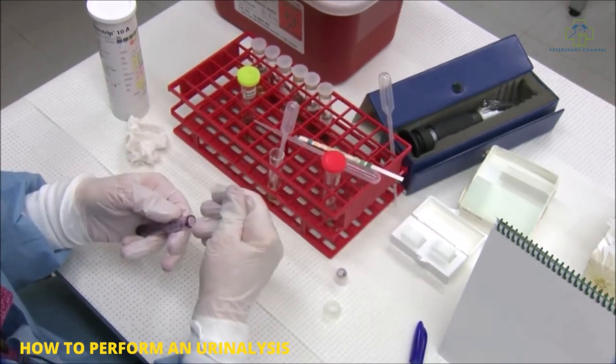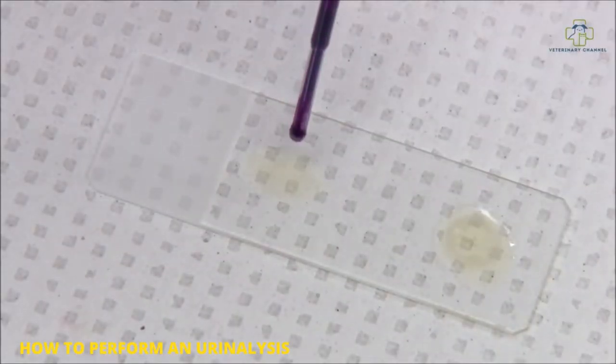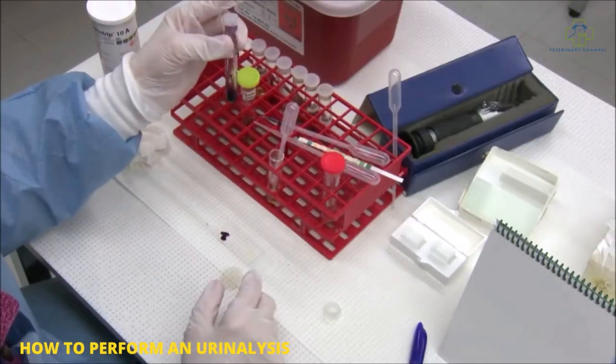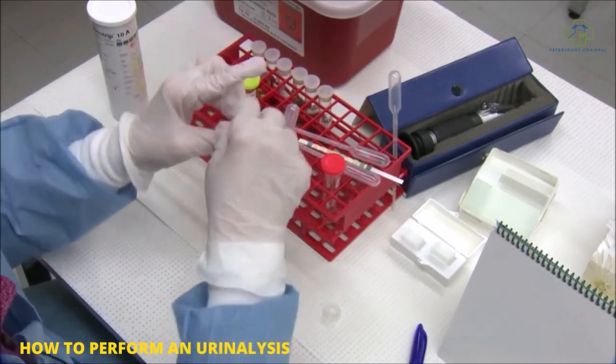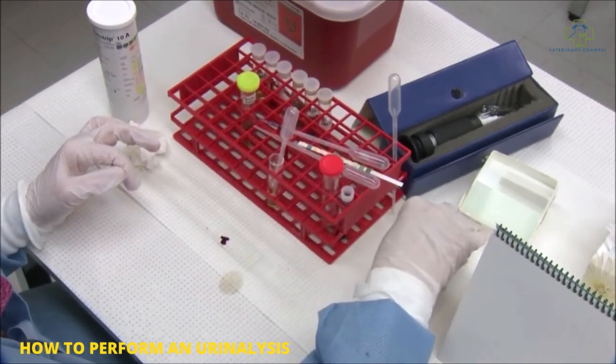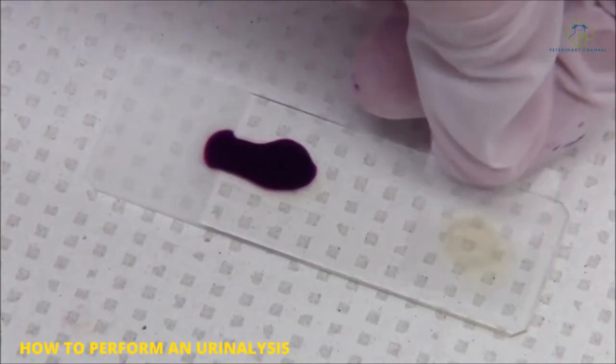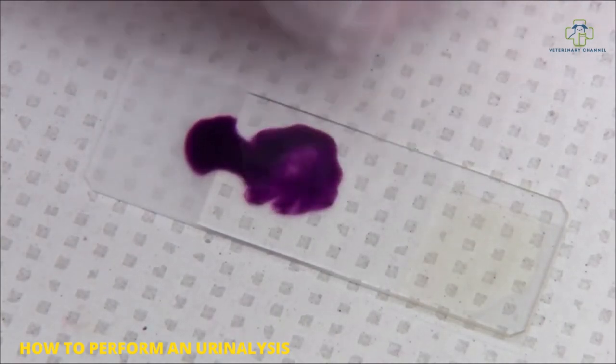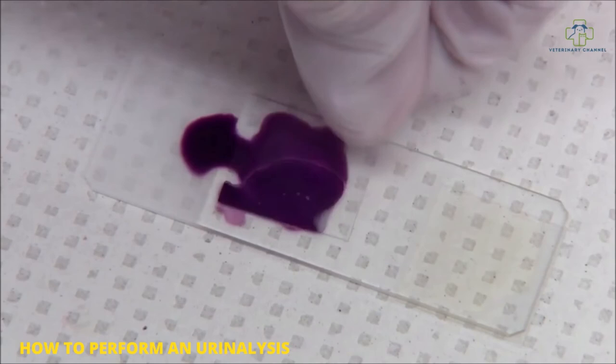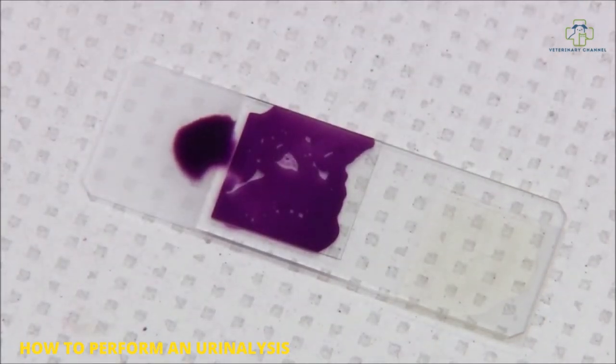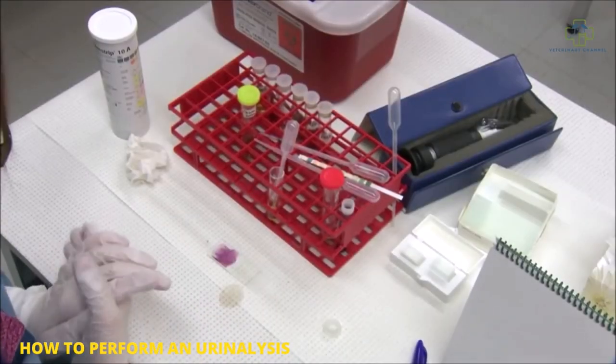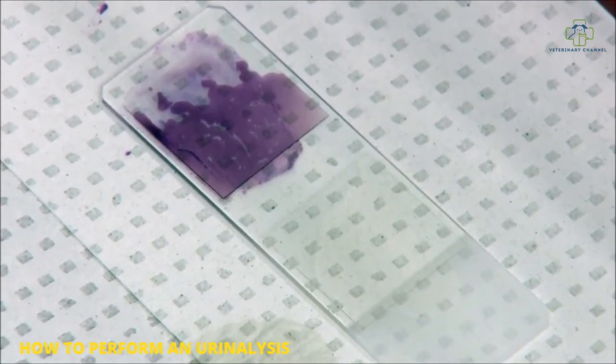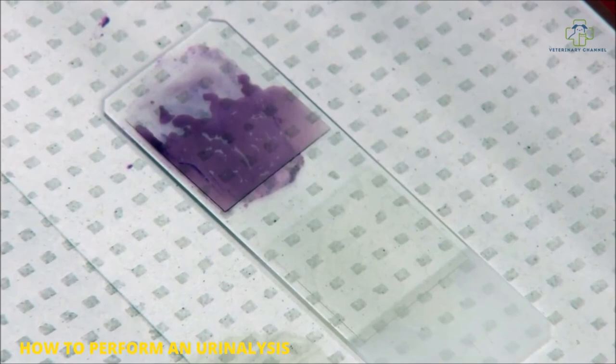Into one of those drops you add a drop of study stain. We aliquot our study stain into little containers so there's less chance of contamination. You want to cover slip both of your drops. The drop that has the study stain in it, you mix the stain and the sediment together with the edge of the cover slip, cover slip it, and you're ready to go to the microscope. Don't be worried if you get bubbles in your urine; bubbles are very good because you can focus on the bubble if you have a clear urine and know that you're on the right plane.